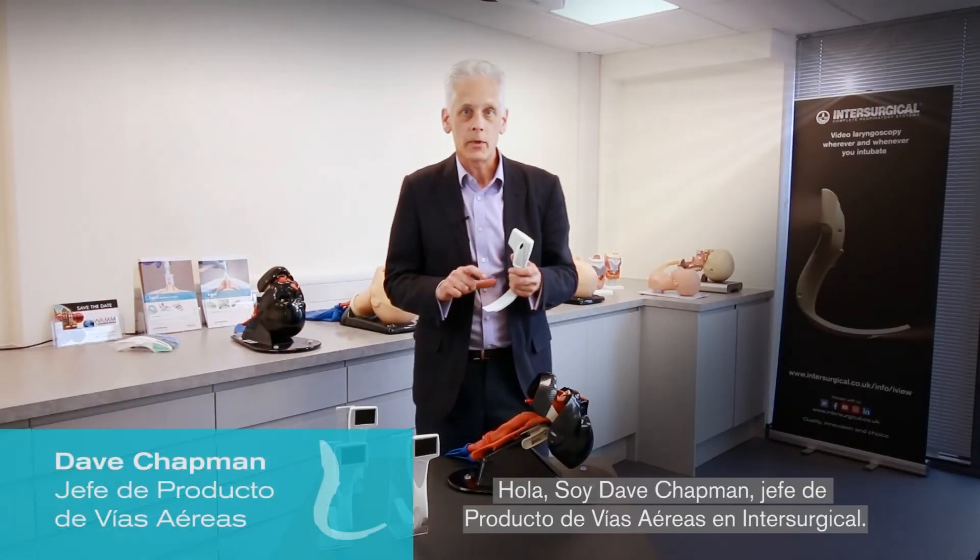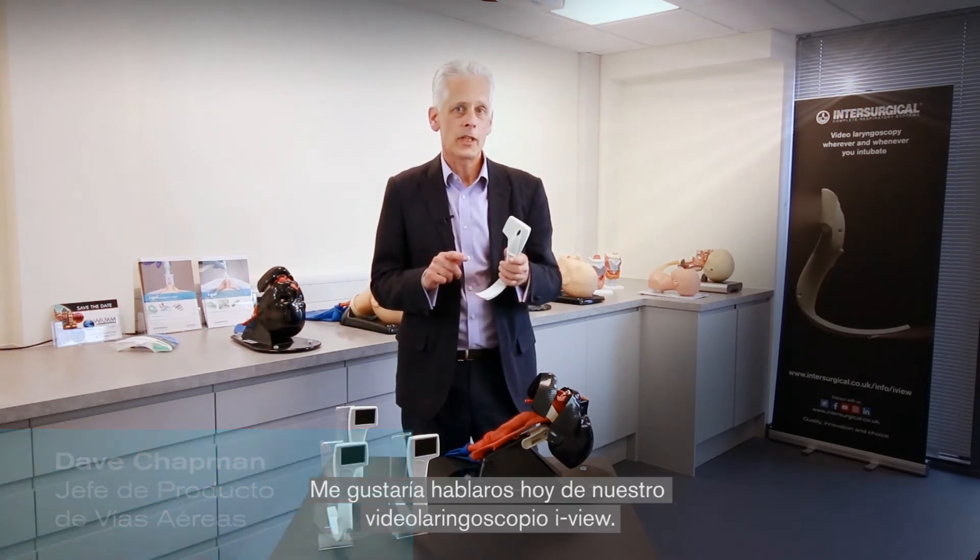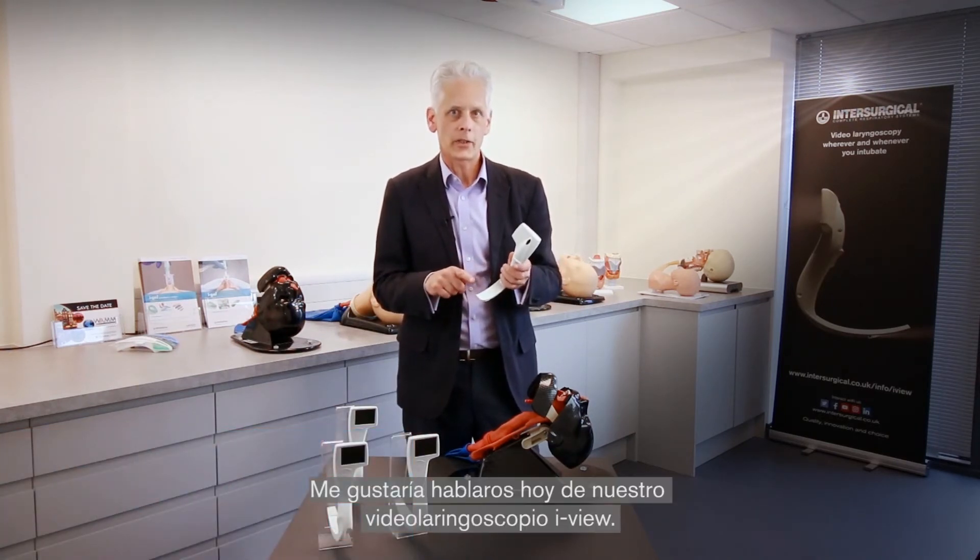Hi, I'm Dave Chapman and I'm the Airway Group Product Manager at InterSurgical. I'd like to talk to you today about our iView video laryngoscope.